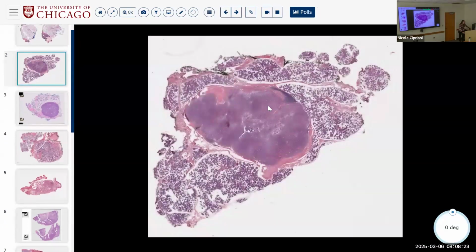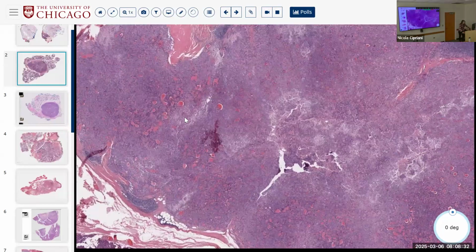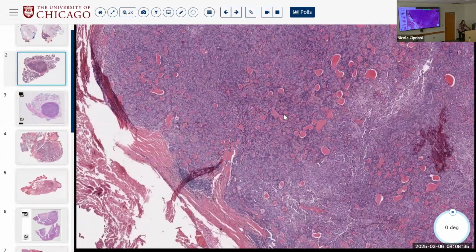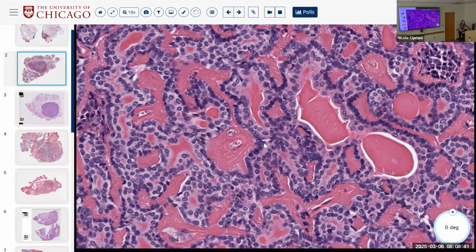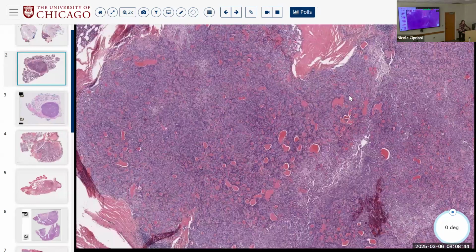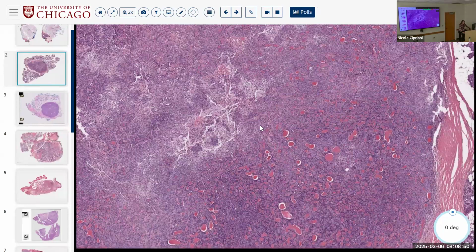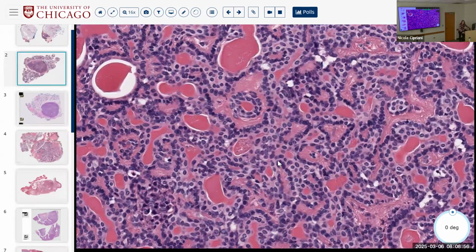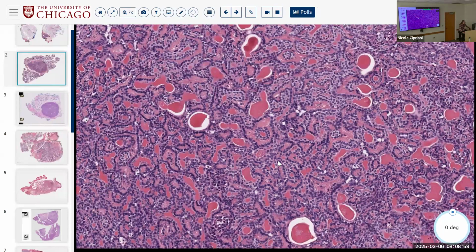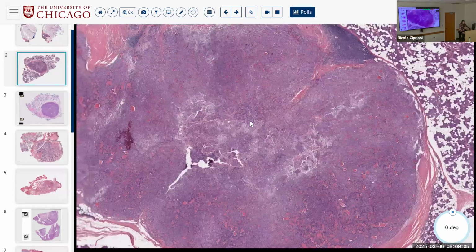Great, so pleomorphic adenoma. I'll just do this one, and then I'll have somebody do the third one. So, who looked at this one and can sort of give a differential for the second one while I drive it around? PA, basal cell adenoma. Mm-hmm. I mean, it's well circumscribed, so most likely to be benign. I felt like I was pretty comfortable with it being a basal cell adenoma because of this basement membrane material everywhere. But what was puzzling to me was the lymphoid tissue that was around it. I was like, is it like a lymph node that's replaced?